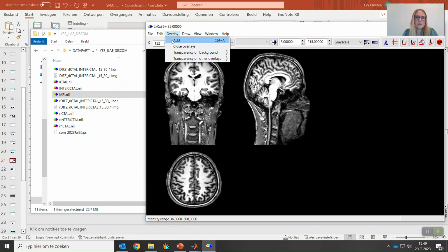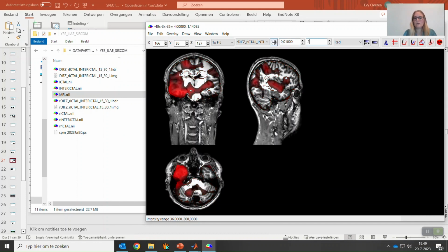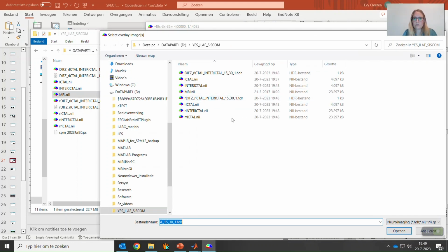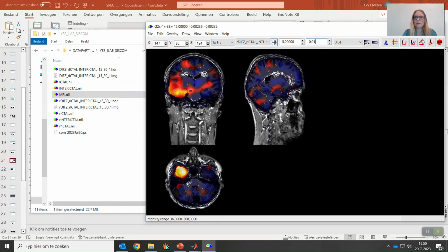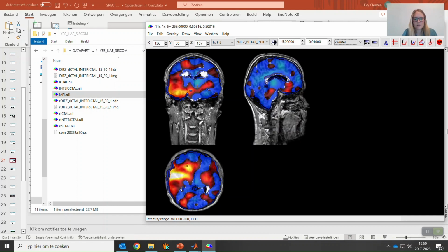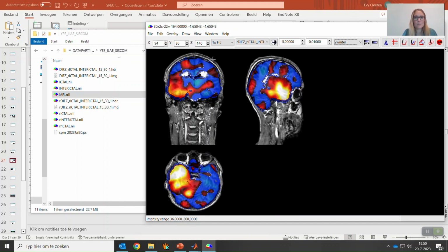And then next we can overlay the difference image. So now this is the R diffs image. And again, you load it, put this in another color scale. So you load it once for the positive values, once for the negative values. And you see here the unthresholded SISCOM image, in which in this case you immediately see a huge blob of hyperperfusion in the right temporal lobe.